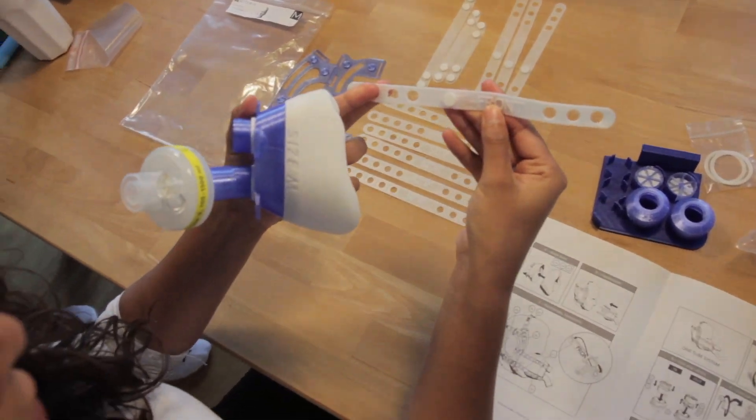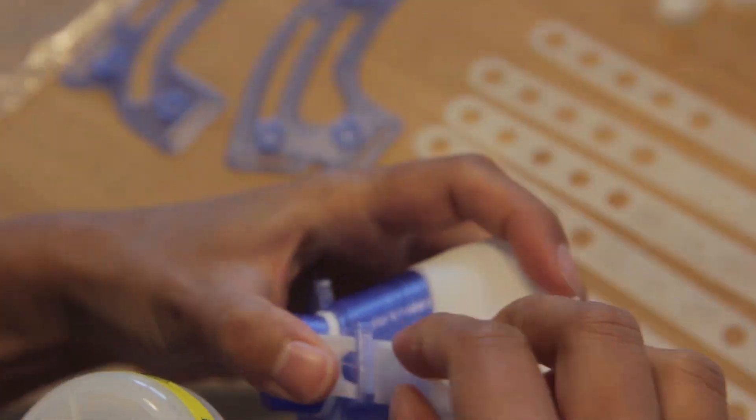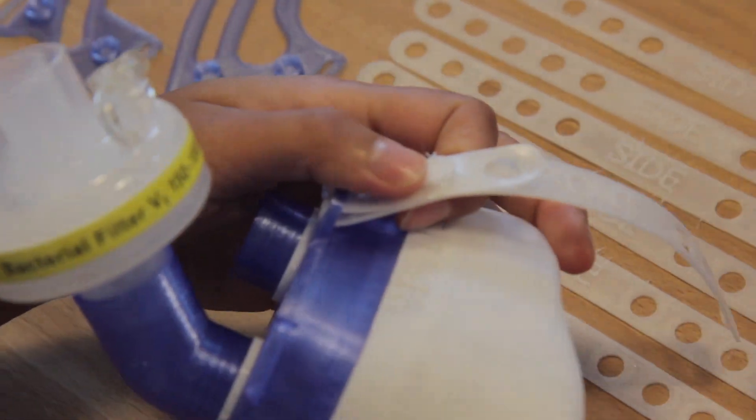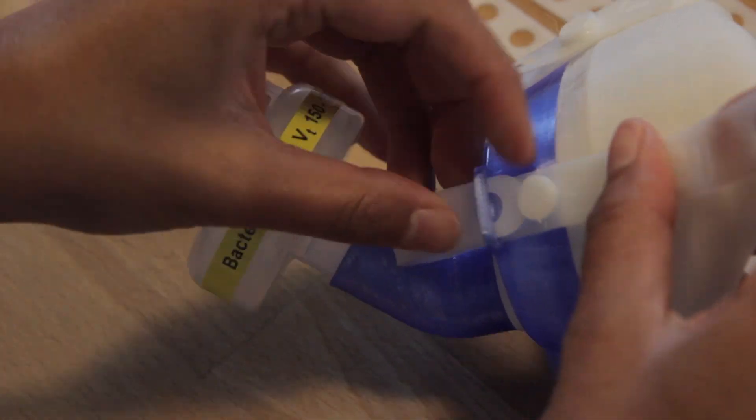Use the four straps labeled front and guide them through the front latch of the face mask. Put the holes over the knob and the mask is connected. Repeat the same procedure for the remaining three straps.